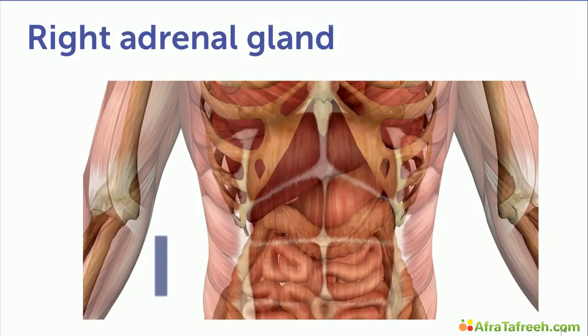So what are the approaches for scanning the region of the right adrenal gland? We can either use a subcostal approach or even better, a right lower intercostal view. We place the transducer either in the intercostal area, in a longitudinal position, or at the right lower intercostal space.